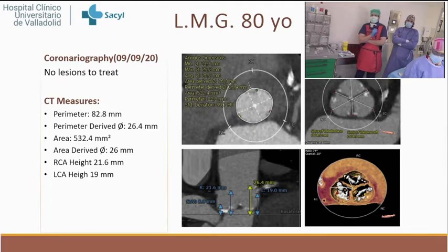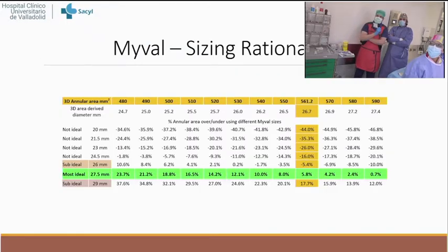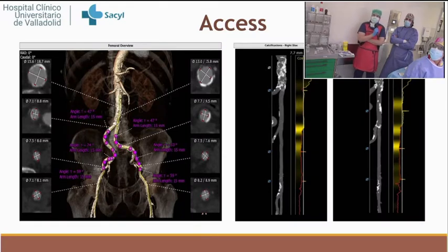The CT measures: a perimeter of 82.8 millimeters, an area of 532.4 square millimeters, and the height of the right coronary artery 21.6 millimeters, and of the left coronary artery 19 millimeters. We have chosen a Myval of 27.5 millimeters because we got an overexpansion of 12% for an area of 530 square millimeters. Okay, next. And the axis, the iliofemoral axis in the right side, we got a minimum diameter of 7.1 millimeters.